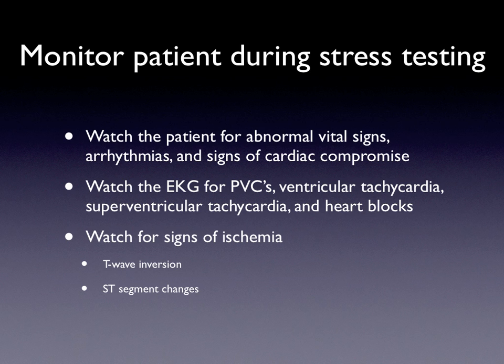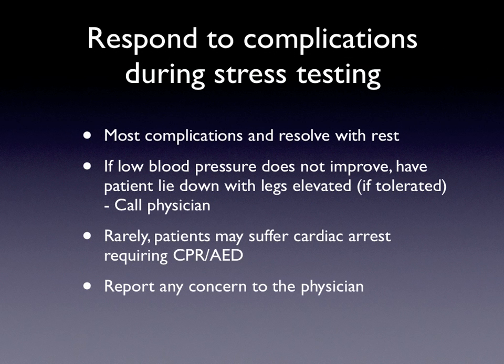Finally, we're going to talk about responding to complications during stress testing. Most of the time, if you stop the test and allow the patient to rest, any sorts of side effects will resolve with a little bit of rest. If you're feeling nervous, call for help. If a low blood pressure does not improve, have the patient lie down with their legs elevated if they can. Sometimes patients don't want that, especially right after they've exercised.